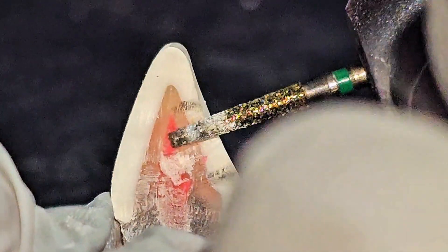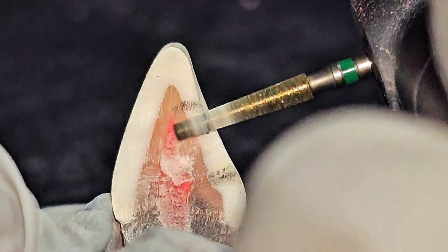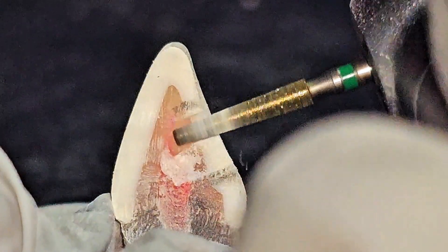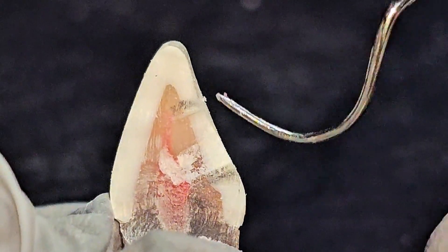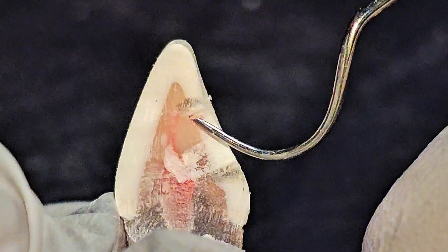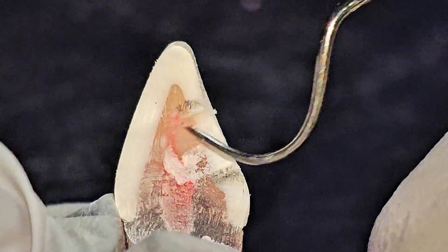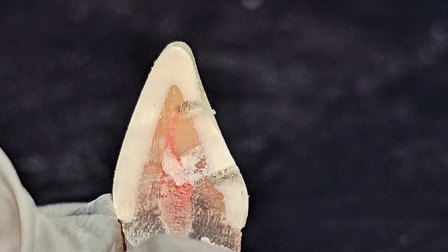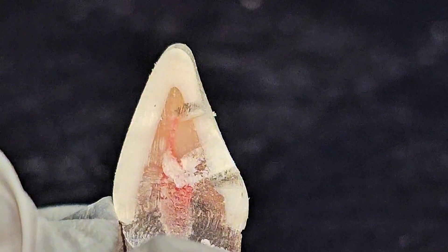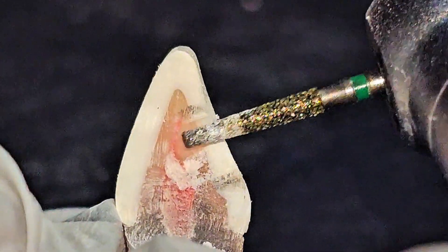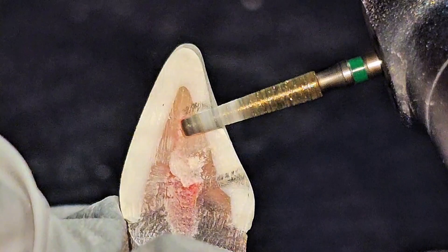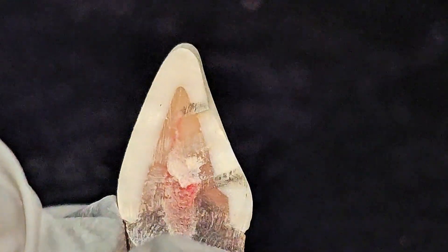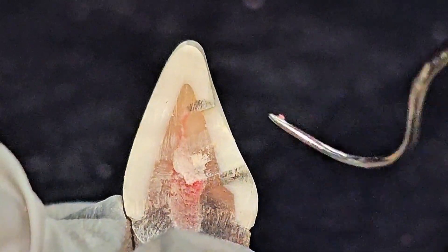So try to touch the labial wall and slide off, slide off. Little by little, we have enough time. So making it really perfect is more important. Almost, almost it is gone. So a little bit more. Okay, okay now it is good.